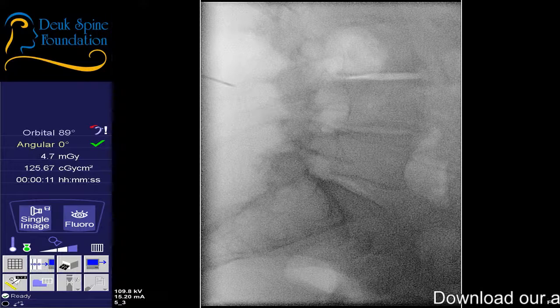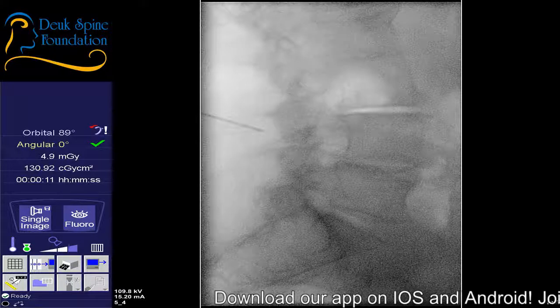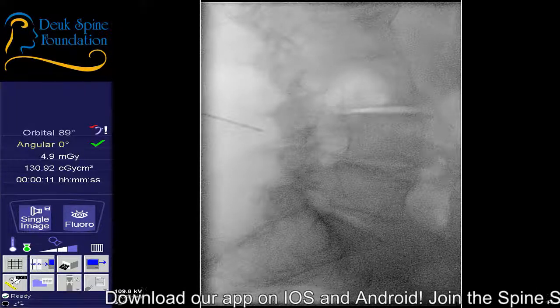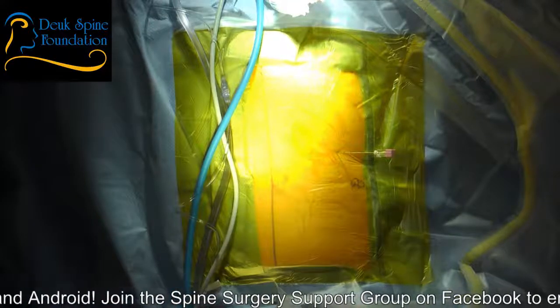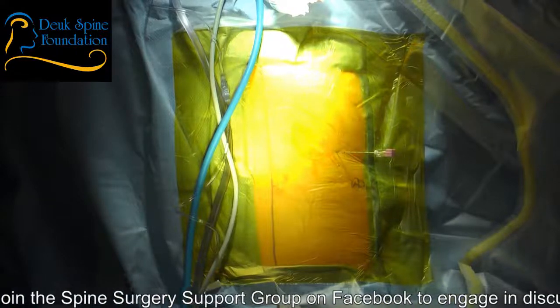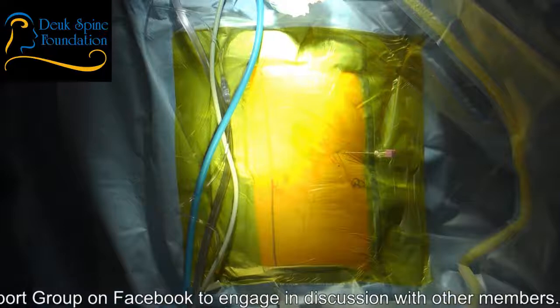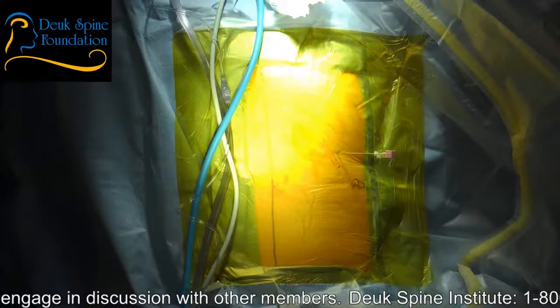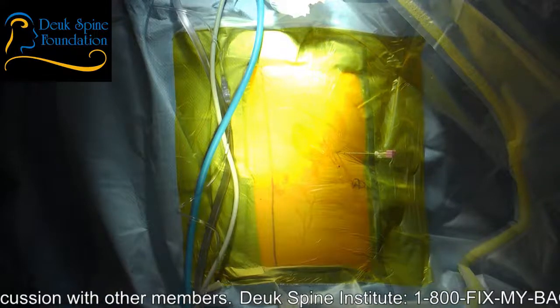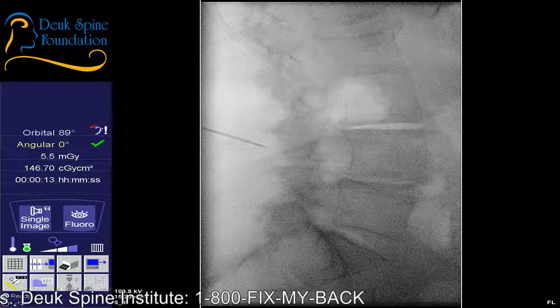Are you comfortable, ma'am? Shot. I think that got worse. Yeah, we go the other way. Yeah, that's actually pretty good. But you're really far south, and I don't want you to be that far south. So let's move everything north. Let's see where you are. Yeah, you're still too far south. Shot. All right, that's better. But let's see if we can wag it back into view, because you're off once again.